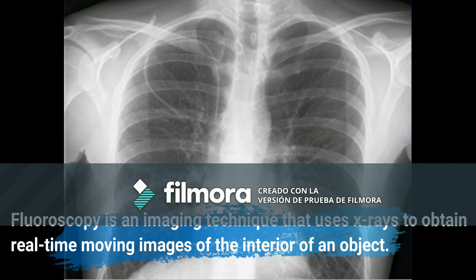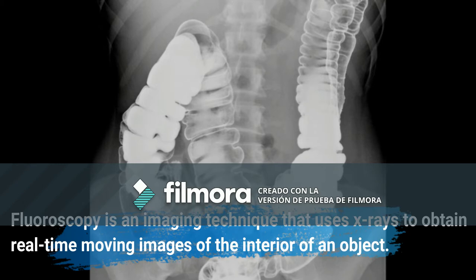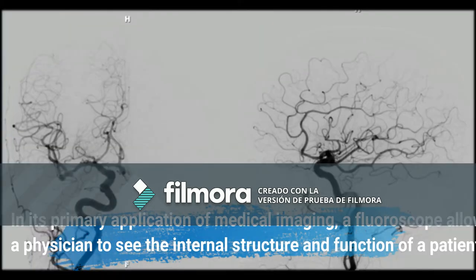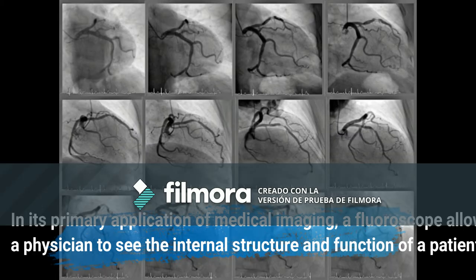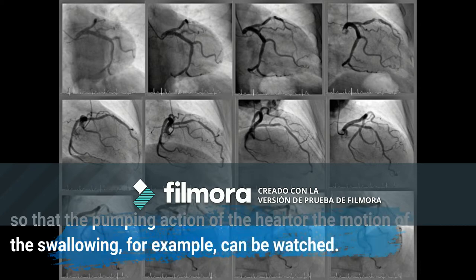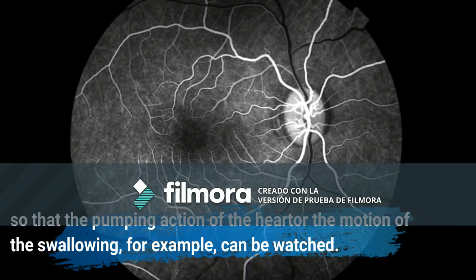Fluoroscopy is an imaging technique that uses x-ray to obtain real-time moving images of the interior of an object. In its primary application of medical imaging, a fluoroscope allows a physician to see the internal structure and function of a patient, so that the pumping action of the heart or the motion of swallowing, for example, can be observed.